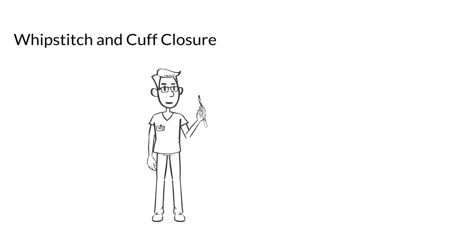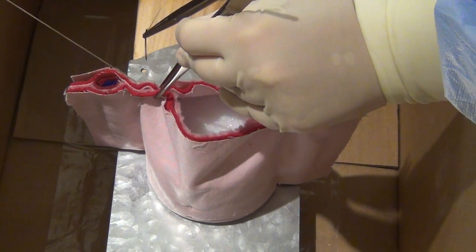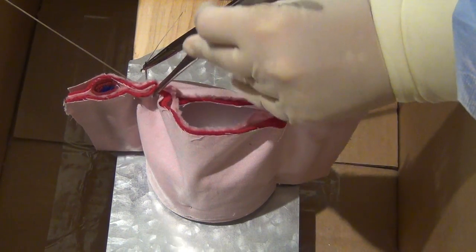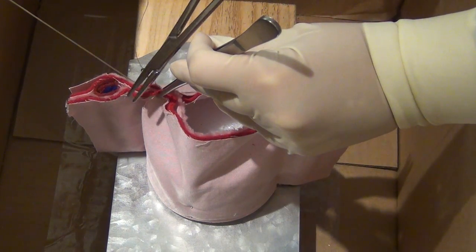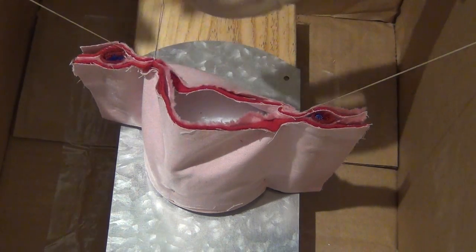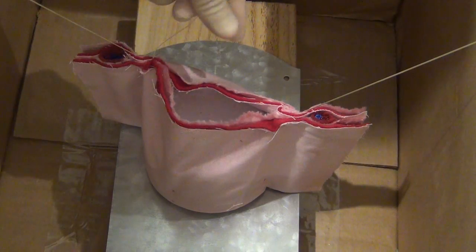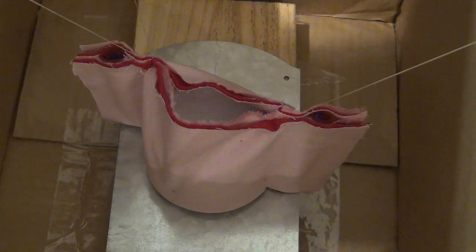Placement of a running whip stitch can prevent cuff hematoma formation. After the whip stitch is in place, the cuff can be closed with interrupted figure of eight stitches. The running whip stitch is first begun by taking a bite through the anterior portion of the vagina. This stitch is then tied down. The short end of the suture is then cut and the long end is used to perform a running whip stitch.